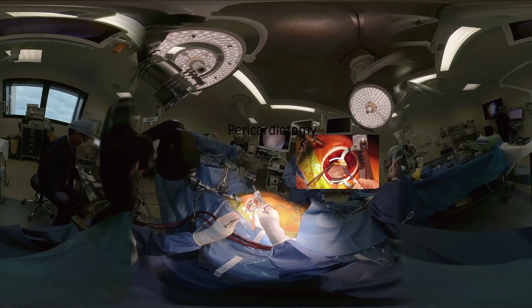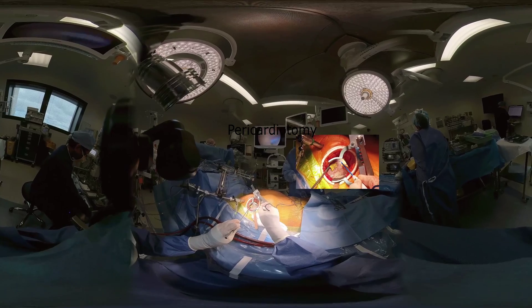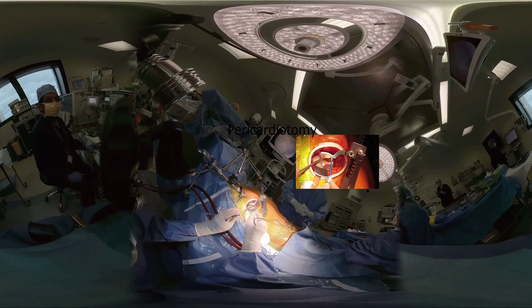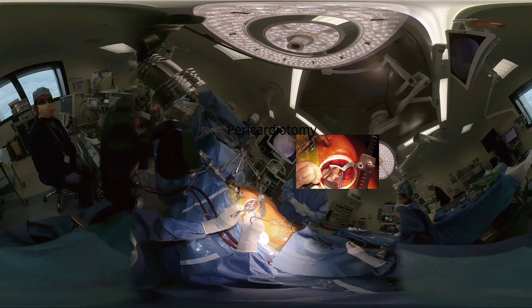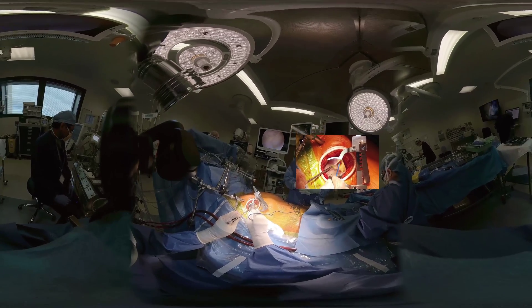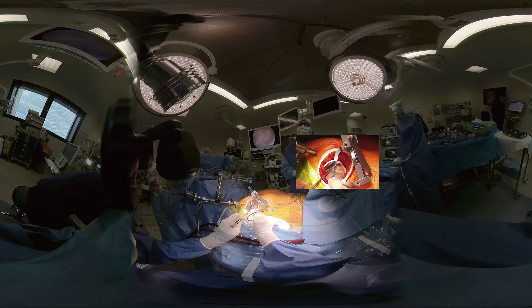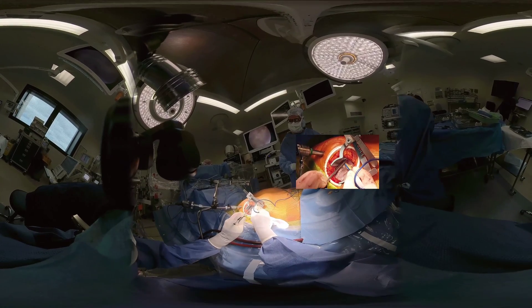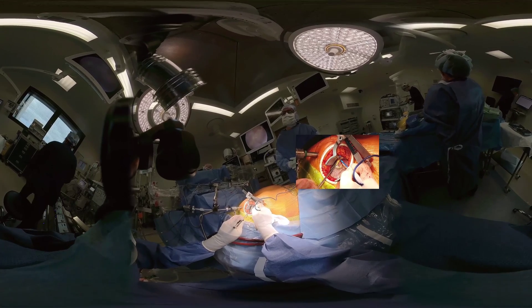Pericardial fat can be excised to give better visual access of the field. For the pericardiotomy, it is good to leave a cuff of tissue anteriorly, so the pericardiotomy is a third of the way back from the front of the pericardium. This leaves enough tissue for closing the pericardium again afterwards, and also gives enough access whilst still giving a good shelf of pericardium which can be retracted laterally, thereby holding the right lung back and giving a good working surface to access the left atrium.